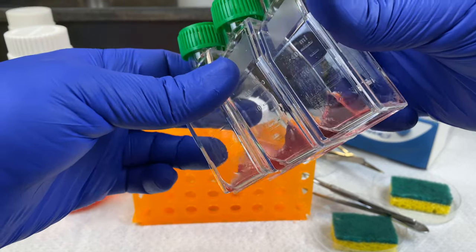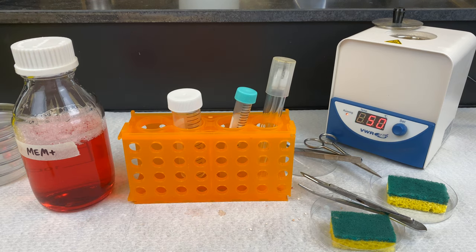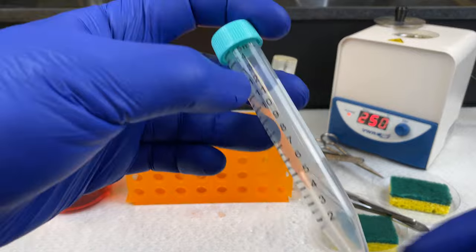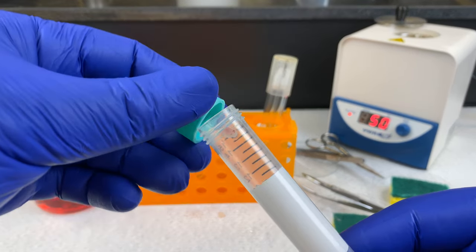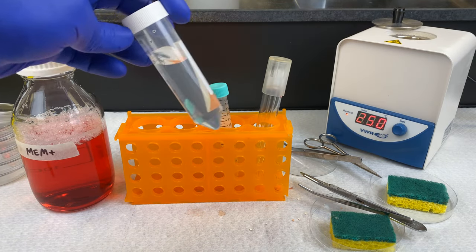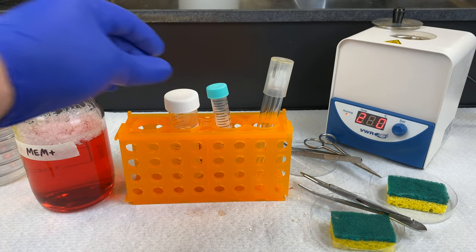There are plenty of cells in there. We'll put those to bed at 37 degrees. Now we'll continue on with our cold trypsin method. We have cooled down the tissue in our 15-mil conical tube for 15 minutes at 4 degrees. I will now add in cold trypsin — here's our trypsin, dissolved in a solution of EDTA and PBS.